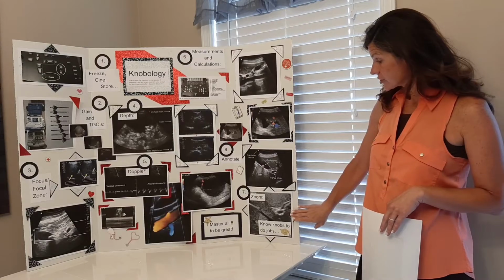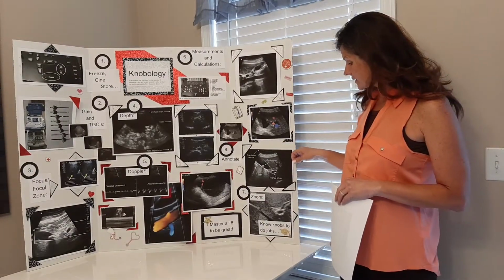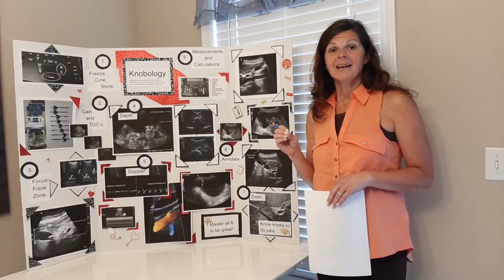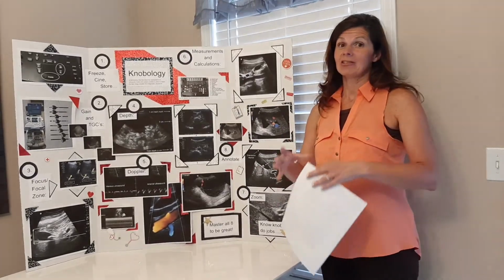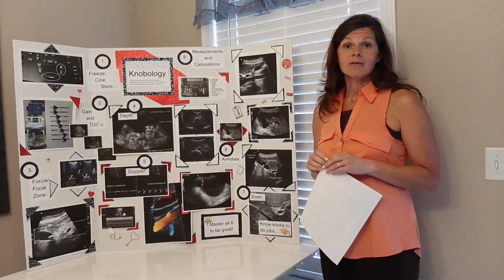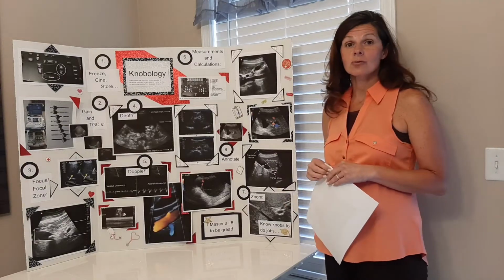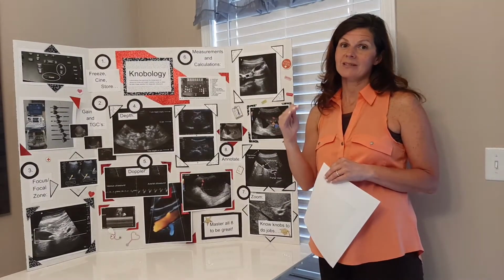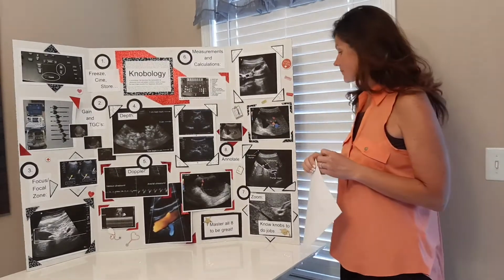Another important feature of the ultrasound machine is the zoom. We have pictures of the common bile duct here. It's very tiny. You can't even see it usually unless you do use the zoom button. Zoom actually just enlarges the image just right where you want to focus the attention. So it just makes it bigger. Zoom is a great way to see a 3 millimeter structure come up bigger, and it helps you place the calipers or the measurements more accurately for those tiny, hard to see structures.